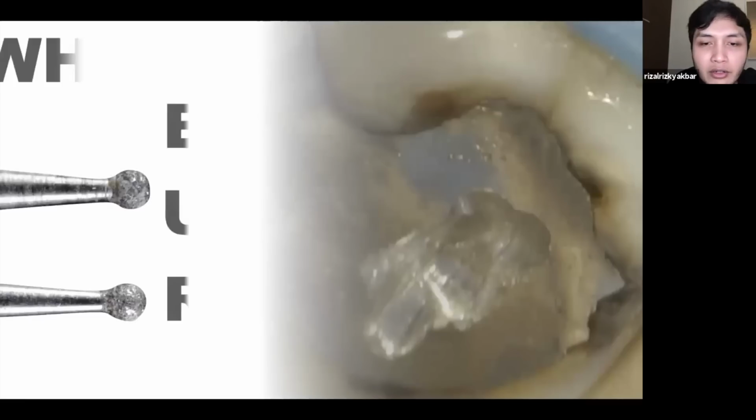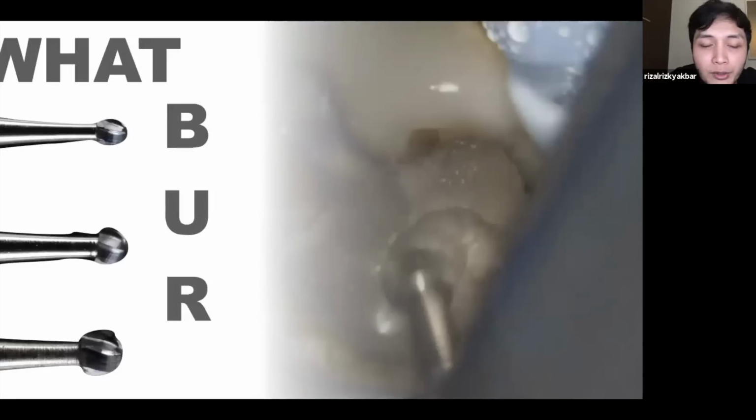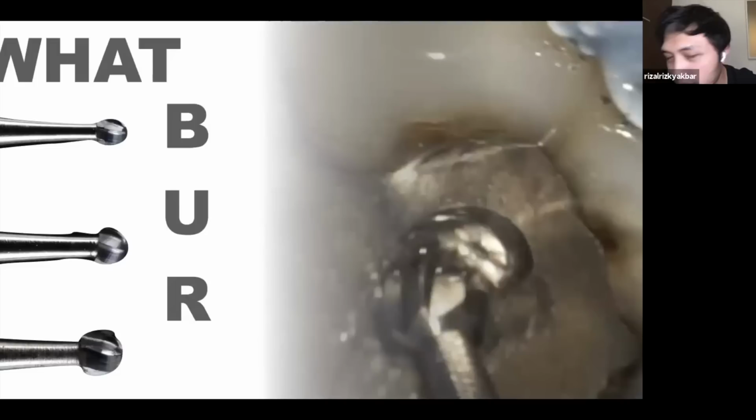But what I like to highlight here is the function of a carbide burr. I really like the carbide burr. I use it a lot, especially when I have to do refilling or replace an amalgam filling, as you can see here. Because I feel that if I use carbide when replacing an amalgam filling, I will cut it into pieces, not into dust. Even if you are not using a rubber dam, it's really dangerous when you only use the diamond burr. So that's why you need to use a carbide for this.